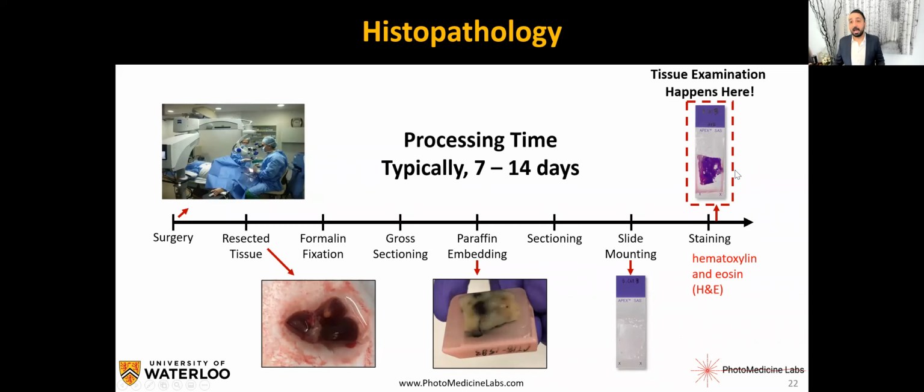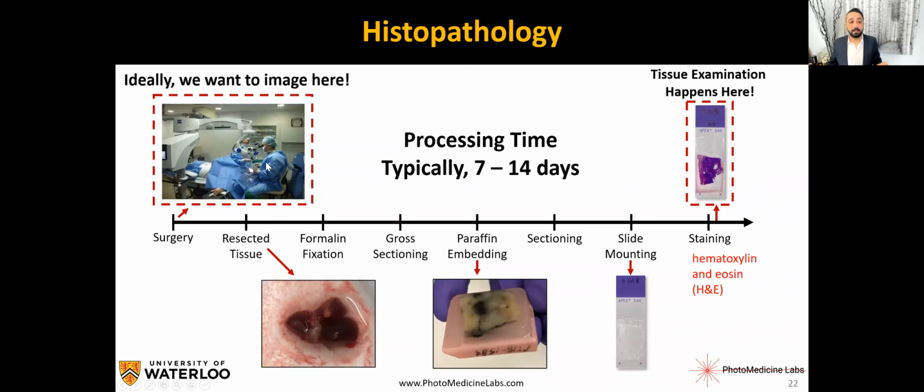Our goal is actually to go ahead and give the same exact H&E images. We are not talking about a different signal. We are not talking about a different measurement. We are talking about the same exact image that all these pathologists, all this department, and all this histopathology field, experts in the histopathology field, have been trained on and are comfortable to look at, analyze and understand. Ideally, we want to do that in situ during the surgery. Obviously, this is a very big and very challenging goal.